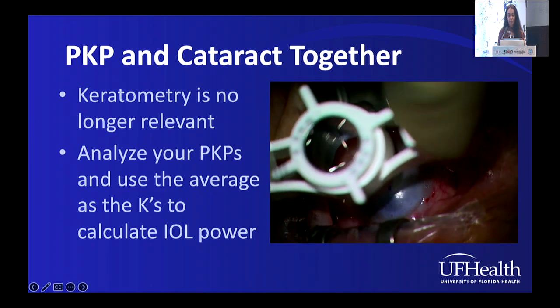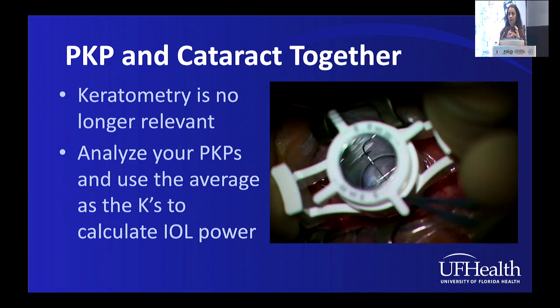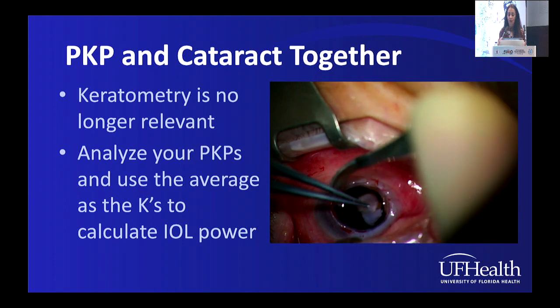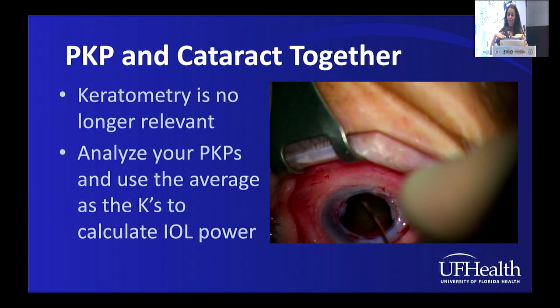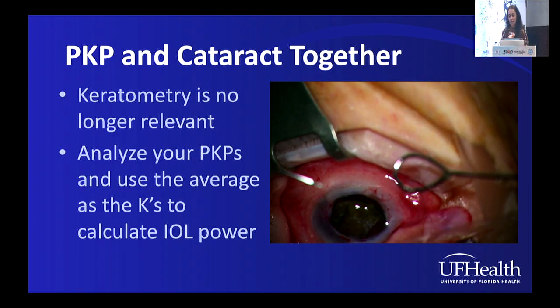And so, when you do these surgeries, suture removal becomes very critical afterwards. Now, this patient is obviously coming from a long distance, so we don't know what to expect. So we're planning to do a triple so that they don't have to have another surgery. My fellow is trying to do a capsulorhexis, but remember, with these patients you don't have a flat anterior chamber or flat anterior capsule, and so they tend to run out. So he did run out, and you can always switch to a can opener.